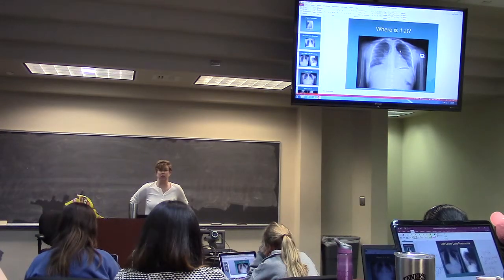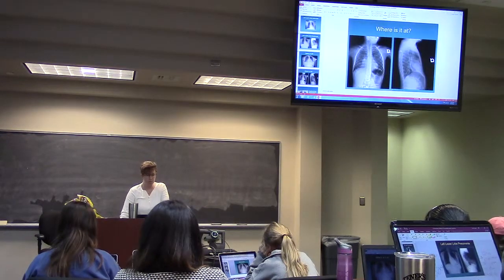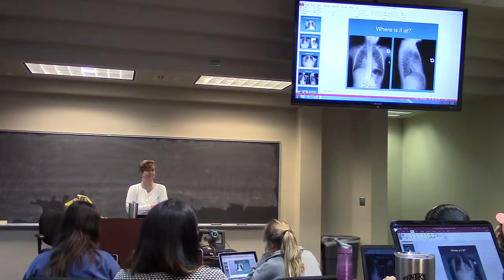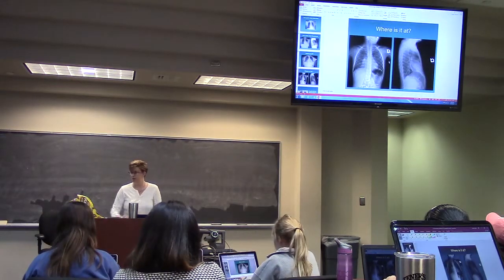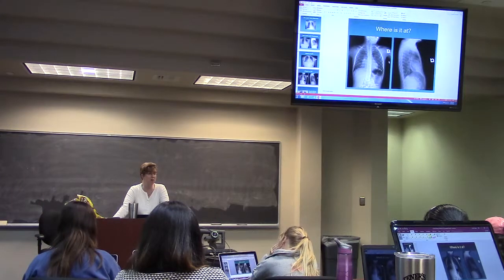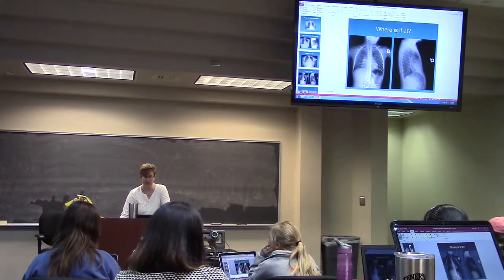My right heart margin's gone. So probably right middle lobe. Where's it at? Right middle. Right. That's correct. The right heart margin is gone. There's a little bit of blurring of the right diaphragm. So you look on the lateral and go, yeah.